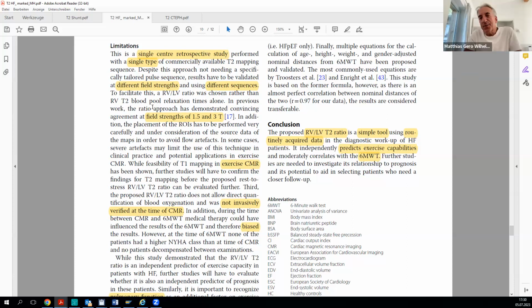And last question from Gustavo Lima de Cruz. Are there any other parameter maps that you're interested in for the future, T2 star, QSM? So T2 star is one of them. Also, we are looking a little bit into these combined T1 and T2 based approaches that have been published by other groups, right? And we would also like to see if the combination of T1 and T2 would help us get further along to also correct for the hematocrit via T1 based imaging.